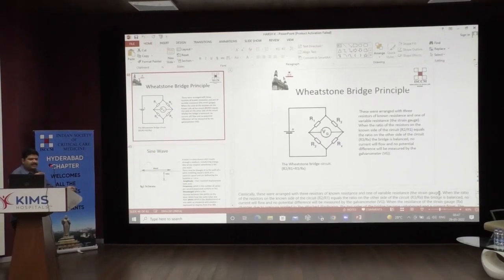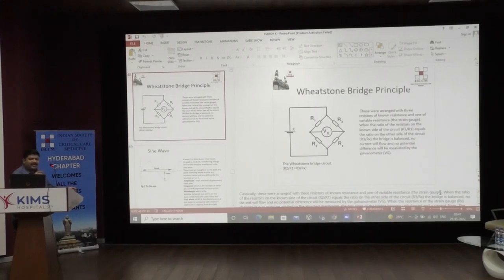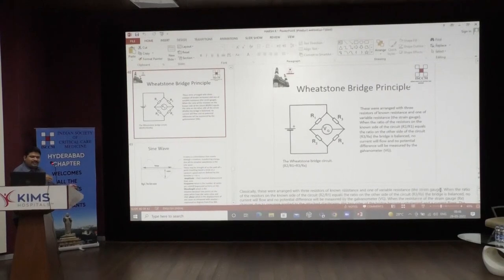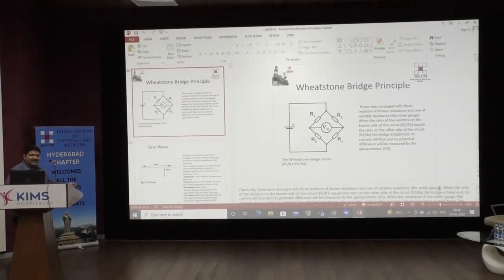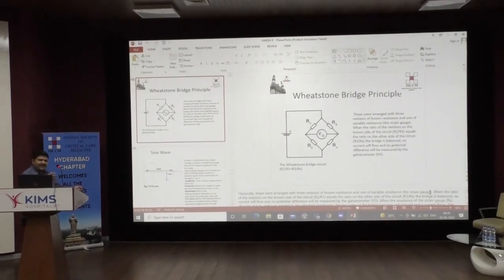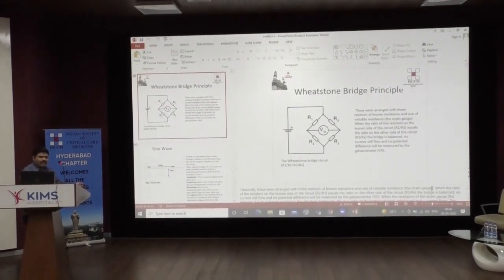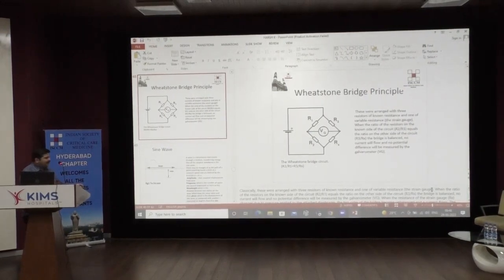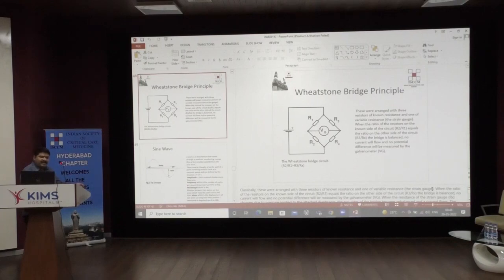Whenever there is a change in the Rx, the resistance, it can be calculated. This change in the resistance is what transduces from the mechanical to the electrical side. This can be further assayed with the algorithm, and the waveform is formed with the constituent waves. So this basically is the changing of mechanical to electrical energy. This is the resistance of that wire that helps you determine the unknown resistance, which changes in the transducer as the pressure changes.